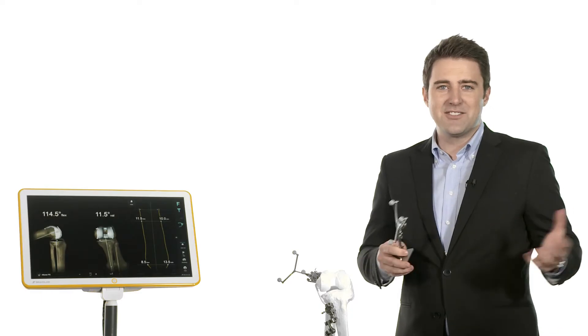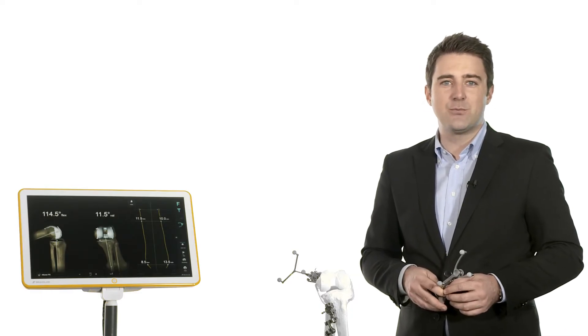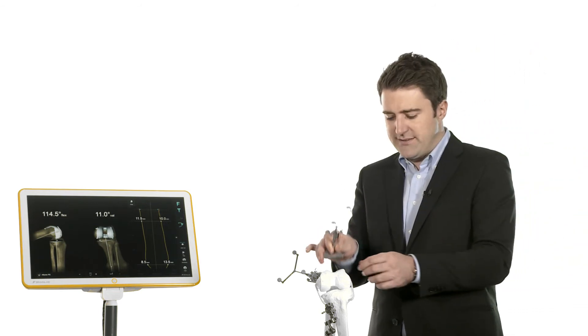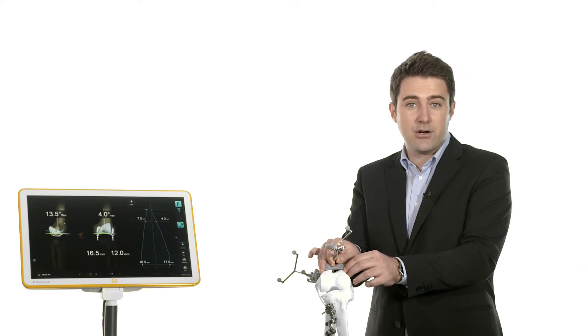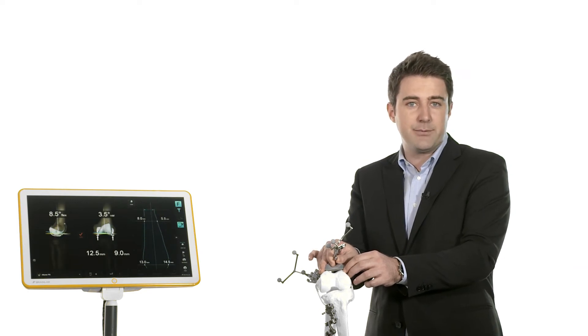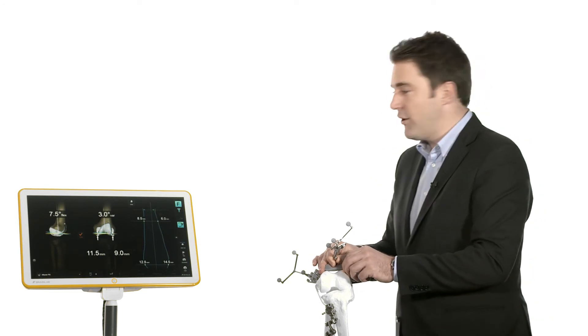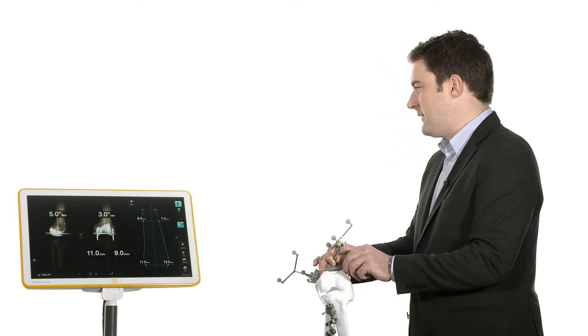This intelligent software automatically recognizes which surgical step the surgeon will perform next. For example, beginning with the distal femoral cut, the cutting block must only be placed at the respective position, and the software automatically jumps to the correct view, allowing navigation to begin immediately.